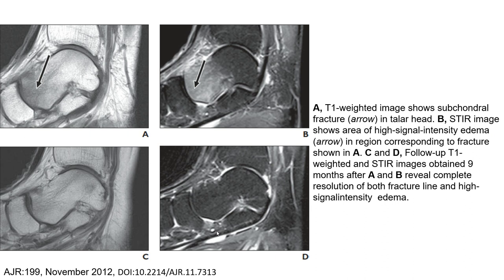This is an example of talar head fractures on MRI. Image A is a T1-weighted image showing a subchondral fracture indicated by the arrow. Image B is a STIR image showing high signal intensity of bone marrow edema, as indicated by the arrow, in the region corresponding to the fracture shown in A.